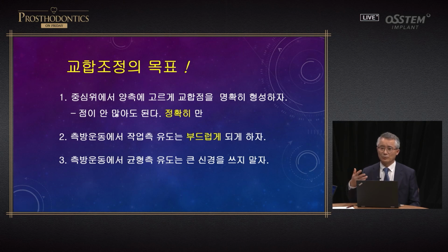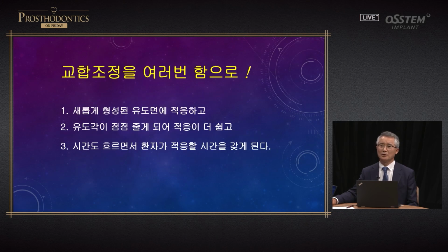If it is possible, then make adjustments. If not, then focus on the guidance for the working side and the lateral movement. So you can make slight adjustments, and then it will suffice. We need to make sure that the guidance for the working side is smooth. That is most important. Then the patient will be able to use it properly.